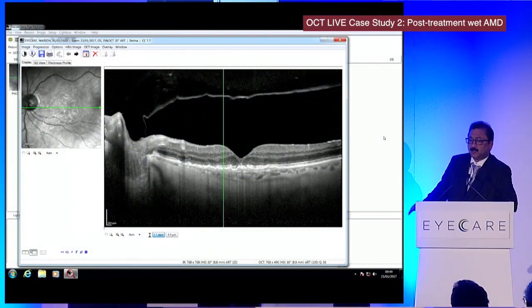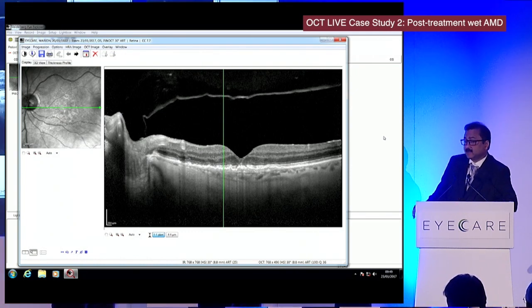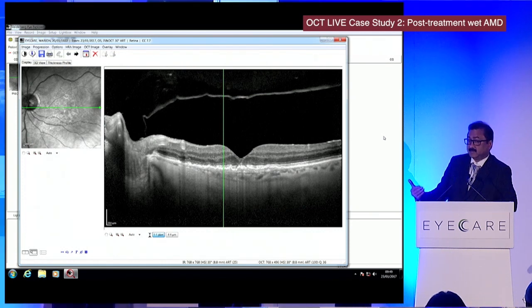Okay. We do a teach and treat clinic in Stobhill Hospital, and I always tell my optoms, don't make a diagnosis just on the basis of OCT. It will help you in making the diagnosis, but it is the full clinical picture that will help you. So always examine the patient in full, including anterior and posterior segments, and then rely on the OCT up to a certain extent. Never make a diagnosis just on the basis of OCT.